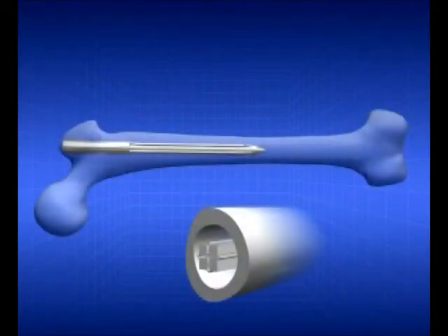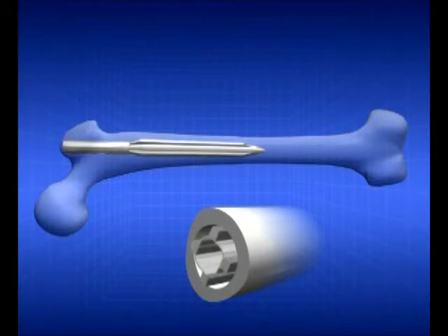The system is composed of two parts. A nail inserted into the medullary canal in a narrow configuration. Once in position, it is expanded and adapts to the inner surface of the bone medulla.